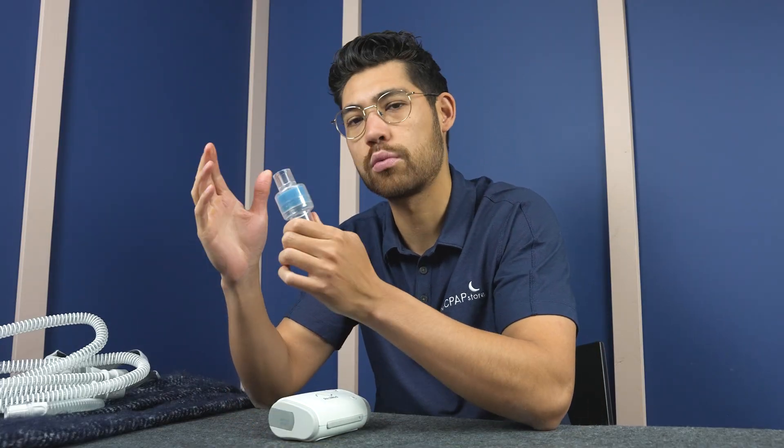Hey there, my name is Tristan from cpapstore.ca. Today we're looking at the Briers HME system for your waterless humidification system for travel CPAP machines. Now you might hear online, just use an HME if you're traveling with your CPAP, but what does that mean?